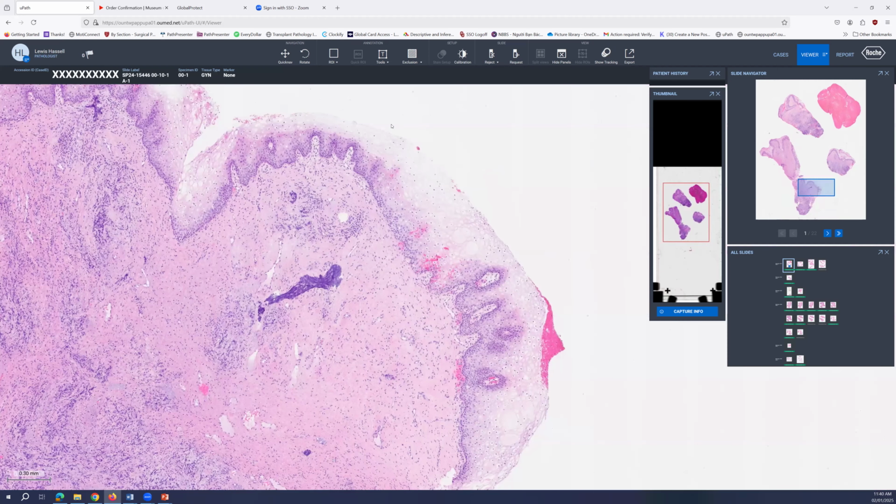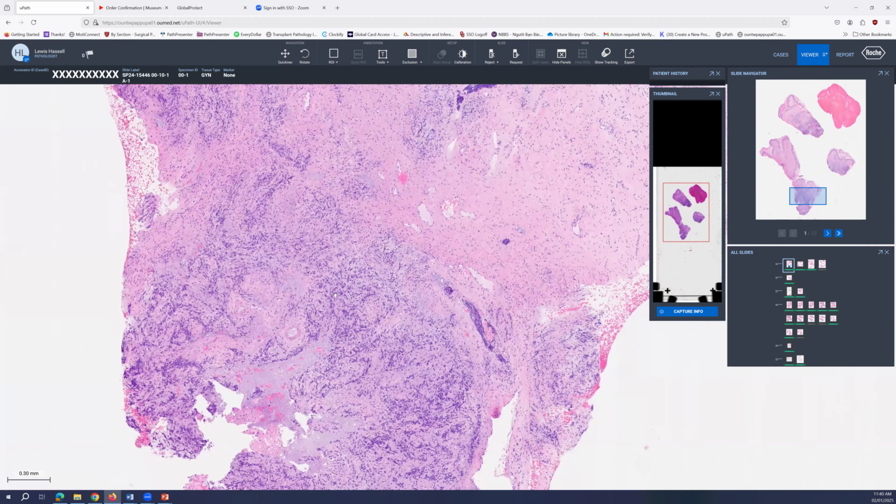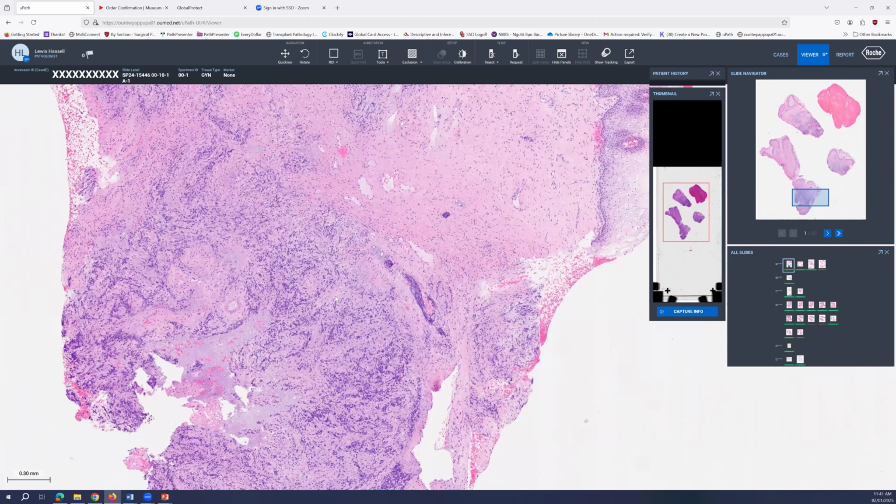So I initially thought, well, what will I do to evaluate this? Is this a neuroendocrine carcinoma? Is it a carcinoma? Are these inflammatory cells? I could do some immunoperoxidase stains. And in fact, those were performed, which showed no evidence of cytokeratin, no evidence of PAX8, and no evidence of neuroendocrine markers. So think about that for a second.